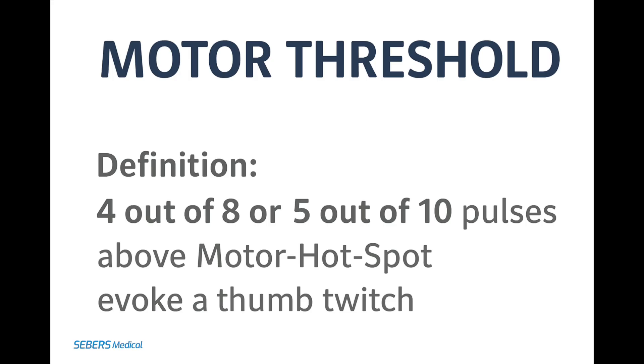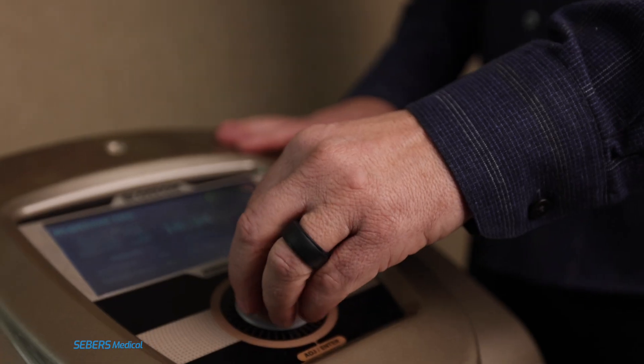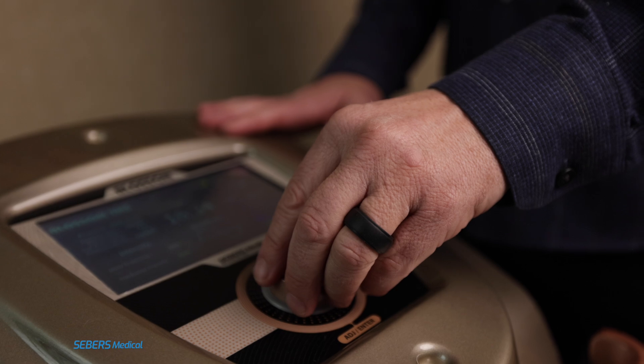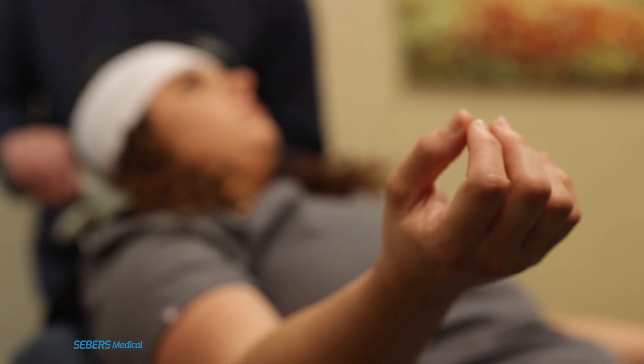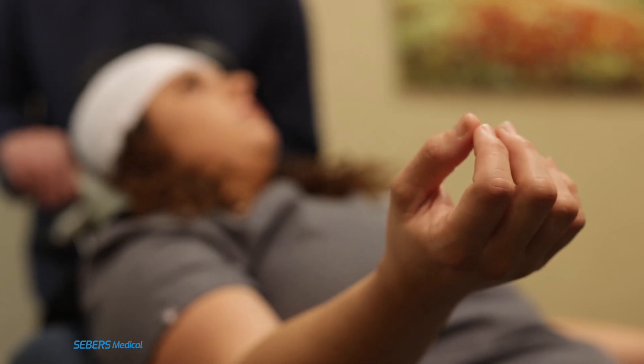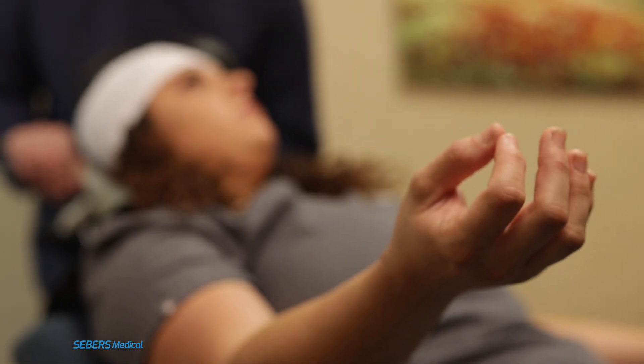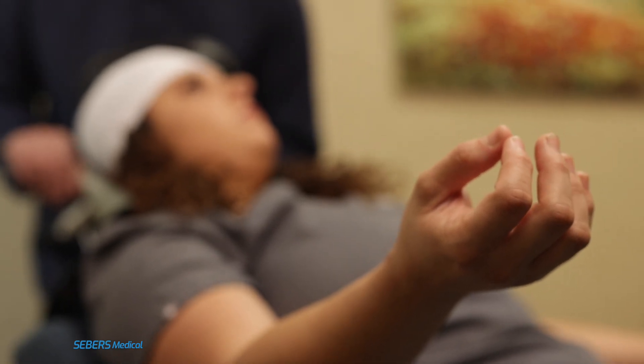Next, we'll determine the motor threshold — the lowest intensity that causes a visible twitch 50% of the time. Adjust the intensity up or down in 5% increments until you find the level where twitches occur in 4 out of 8, or 5 out of 10 pulses. That's your motor threshold. Once you find it, be sure to write it down immediately.